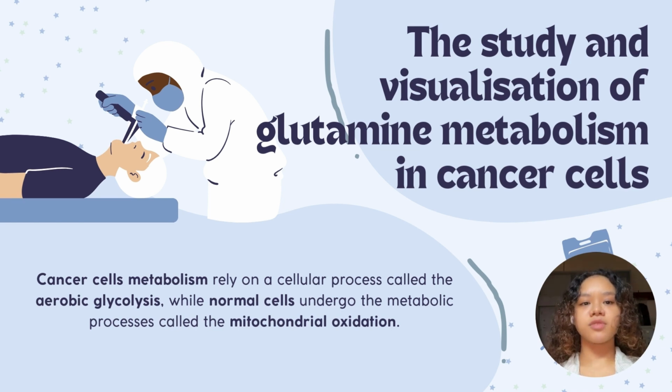It detects several aspects of tumors, such as vascularization and perfusion, transporters, receptors, expression of genes, and most importantly, the metabolic processes of the tumor, which we would like to focus on today. For instance, this is the study of visualization of glutamine metabolism in cancer cells.